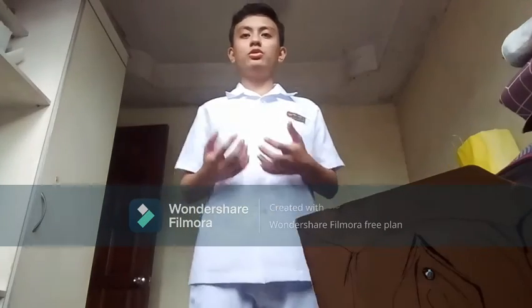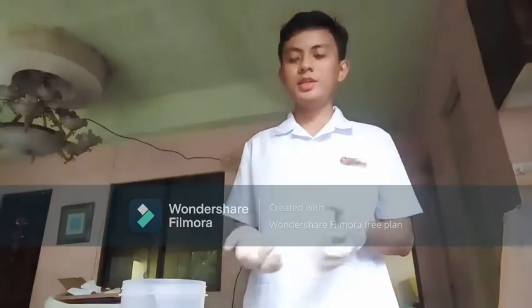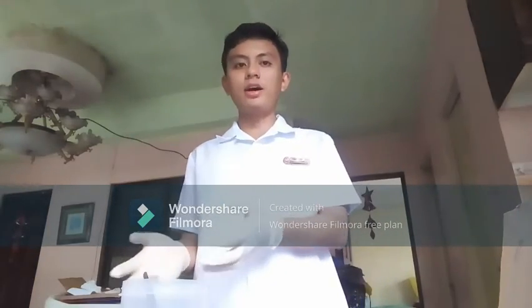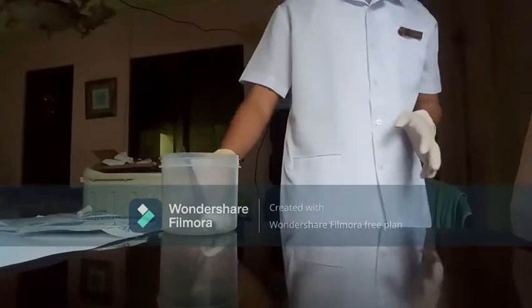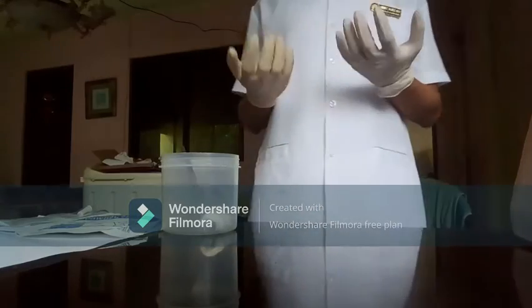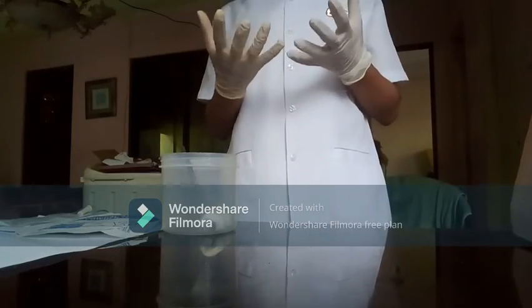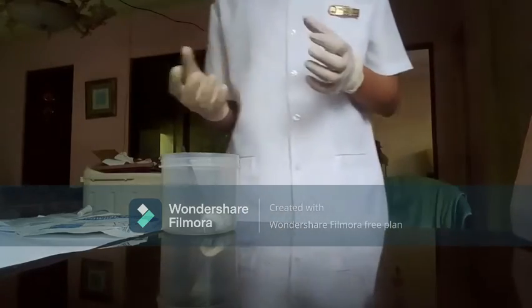So we must do hand hygiene. The items are right over here, the sterile field as well. Then we put on the sterile gloves. So make sure you are not touching anything now.